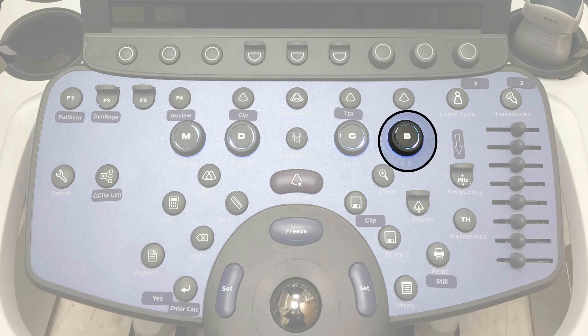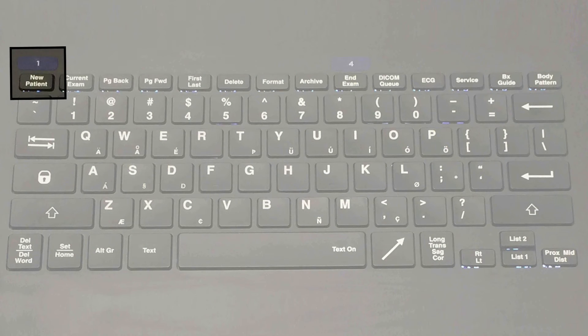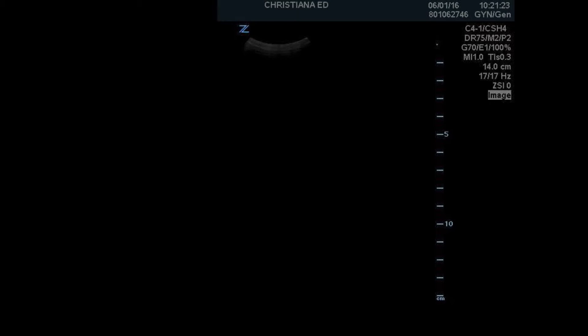Another option is you can press the B button to go to B mode and imaging. You can also press the new patient exam button again to exit the new patient screen. You will then be taken to the full screen mode to begin scanning.